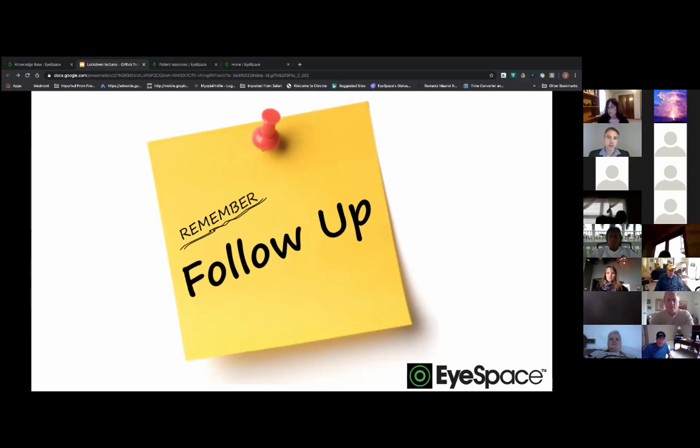You want to look for lens movement. You want to do that over refraction, the refraction over lens. You want to make sure we've targeted the correct myopia correction or hyperopic correction. And you want to make the patient just sit in the chair or lie down on the couch for a good 10 to 15 minutes with their eyes closed.